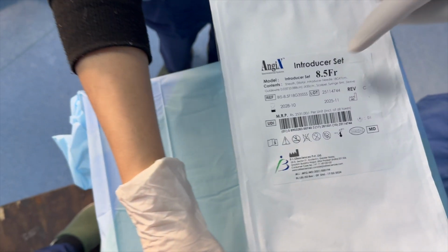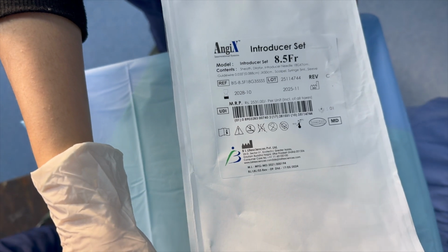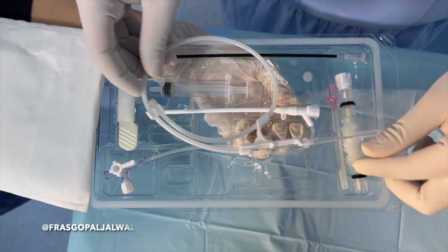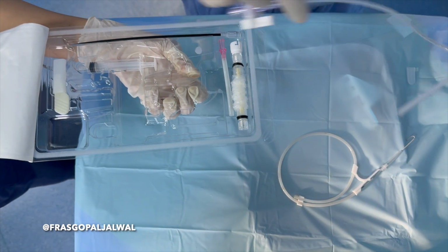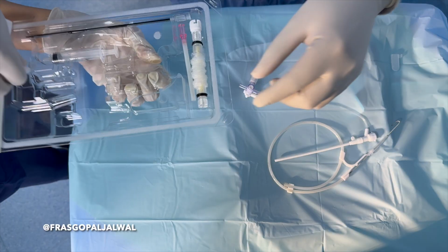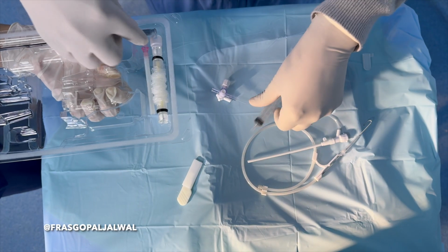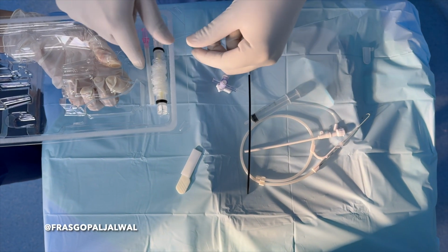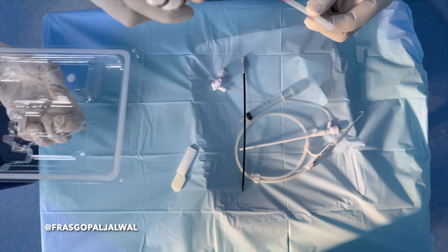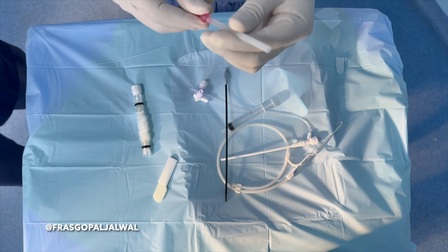So this is the introducer set, 8.5 French, through which we insert the PA catheter. Let's see what it includes. Here you can see the guide wire, and second, this white color introducer sheath and blade, and a 5 ml syringe. And this black color is the dilator, and here you can see the transparent sheath to cover the PA catheter to maintain sterility, and this is a puncture needle.